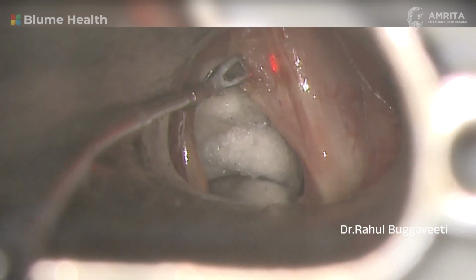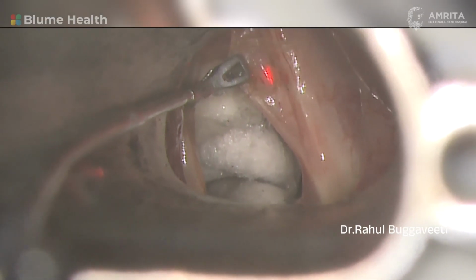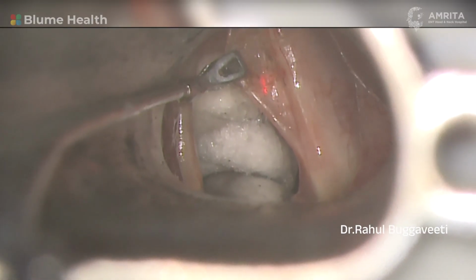So in this way, gently the cyst wall is separated and make sure we don't leave behind any cyst wall to prevent recurrence.